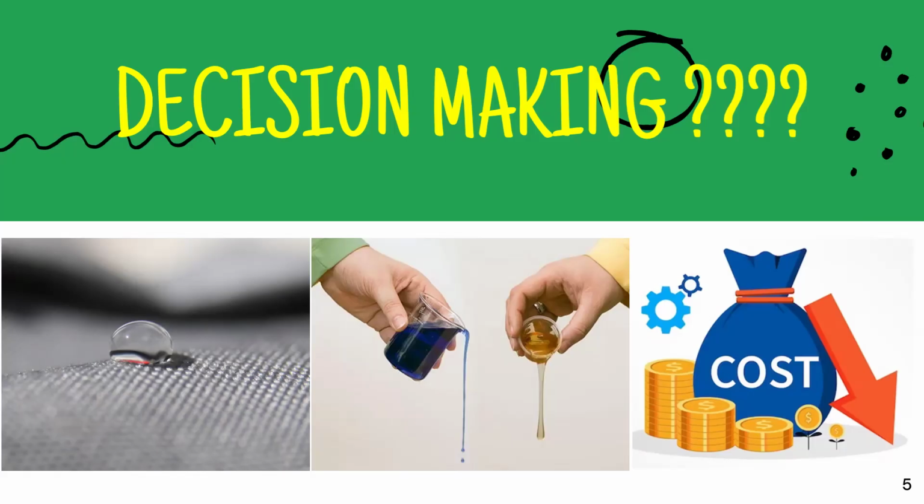Consistency depends on whether we are capturing fine details, or just trying to capture the body of the material, or whether we are using the material as a tray material. And the last, and equally important, factor would be the cost of the material. It is very important that the impression material, the equipment, and the tray all come at a reasonable cost.